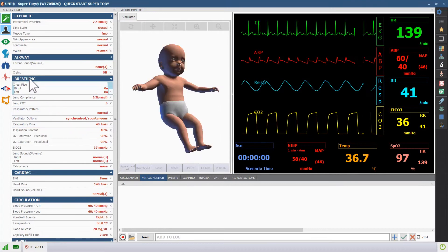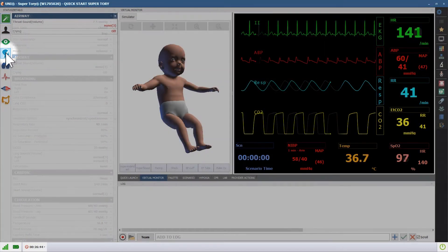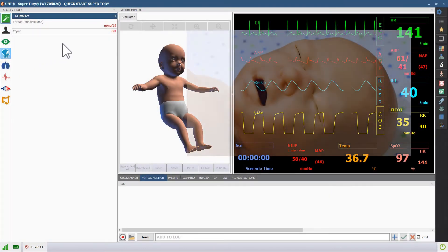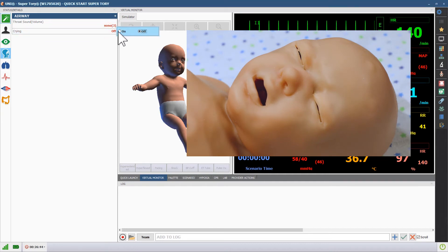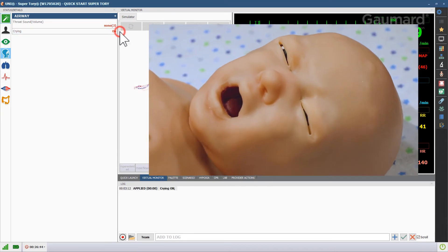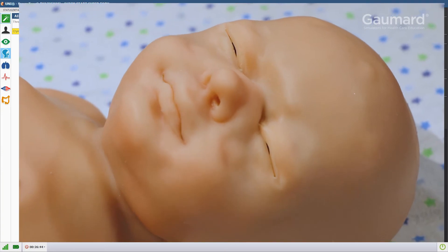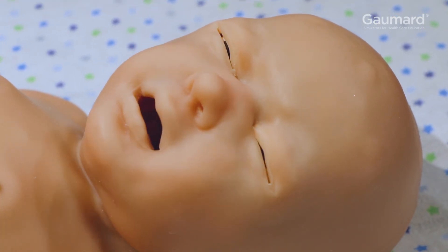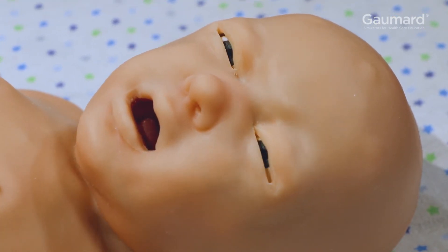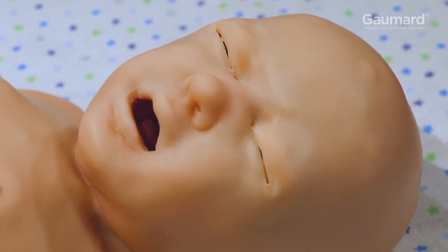To activate crying, open the airway submenu and click the crying vital. Then click the button next to on. While Supertory is crying, the mouth and eyes will move realistically.